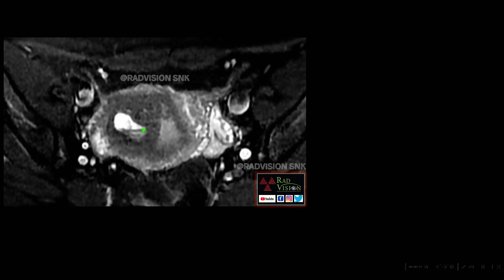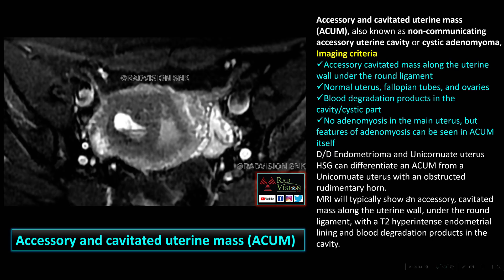This is the first case where you can see there is a T2 hyperintense cavitary lesion noted in the uterus, separate from the endometrial cavity, along with blood degradation products and fluid-fluid level. Whenever you see a cystic lesion in the uterus not communicating with the endometrial cavity, with abdominal pain and bleeding symptoms, definitely suspect Accessory Cavitated Uterine Mass — that is ACUM.